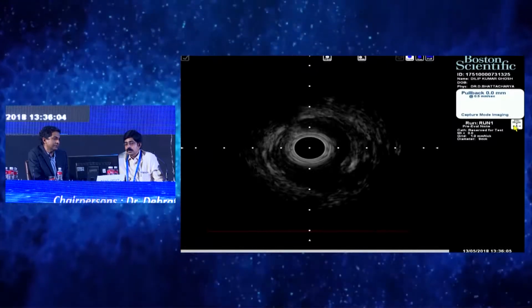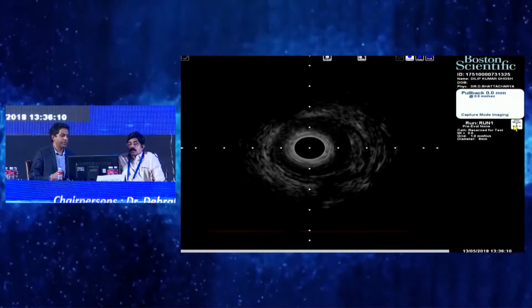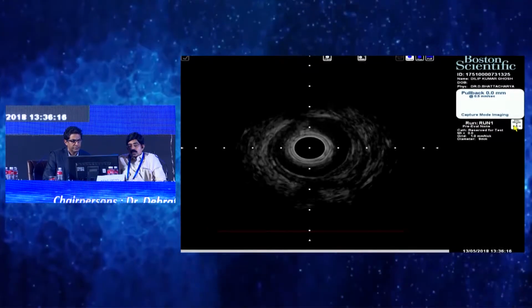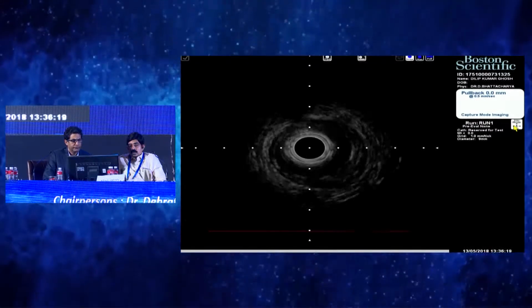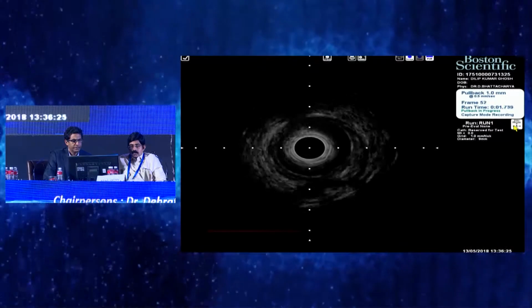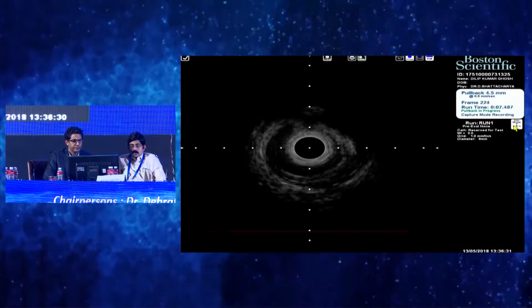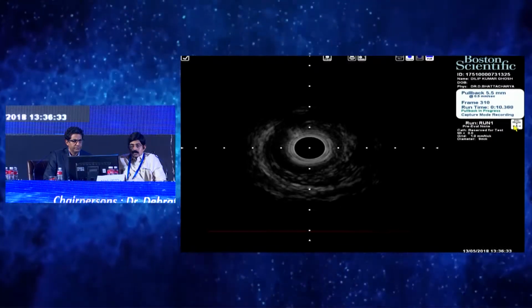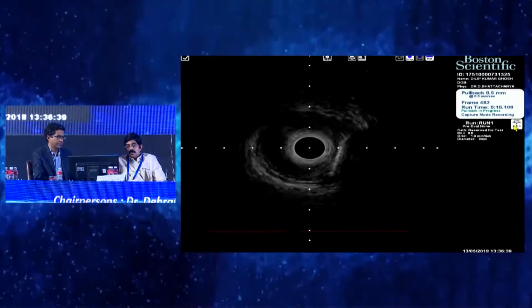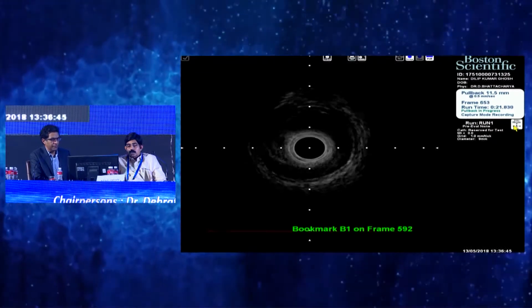So I'm going to show you where it is. It is beyond that distal 40% lesion. The probe is there, and I'm going to do a pullback now. So press the pullback button, and you should be able to see it. As we are coming up, maybe you should see both the IVUS screen, how the catheter is coming back, and then you can correlate a little better. Otherwise, I'll give you a commentary. We are not yet at the CTO, so we are coming back slowly.